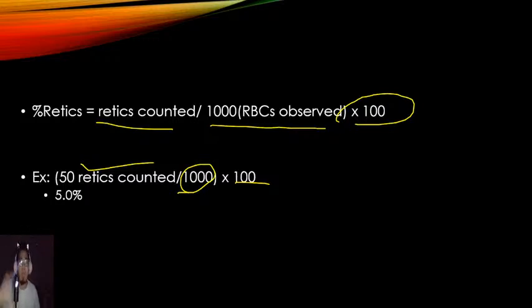You don't need to count 100 RBCs per field. Okay? Makinig kayo kay Sir Manuel kasi minsan may kanya-kanyang secret technique yung mga medic.